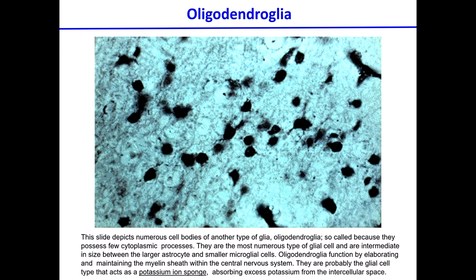This is the oligodendroglia. Oligo means, again, scientists like that, a small number or few. The name of these cells means that they have a small number of processes. In fact, I will bet the other half of my salary with anyone who can see anything that resembles the processes of the astrocytes we've seen before.